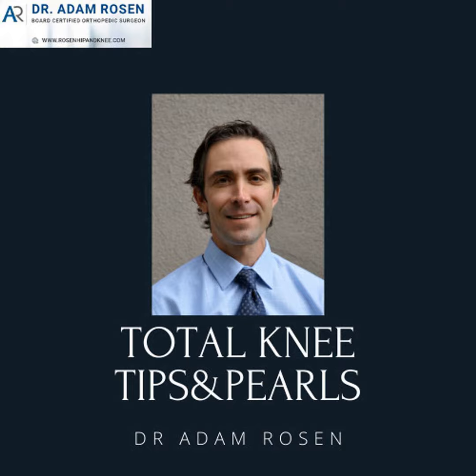If you have a small little defect or void, you might fill it with some extra cement or do some impaction bone grafting techniques depending on where it is. But these are small. These are small enough that you wouldn't cut excess bone just to fit in a cone or augment or wedge or sleeve or something like that.